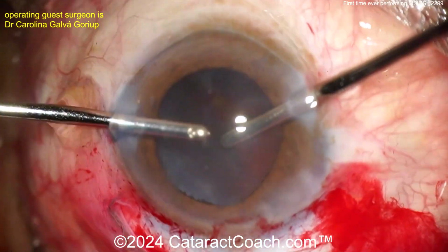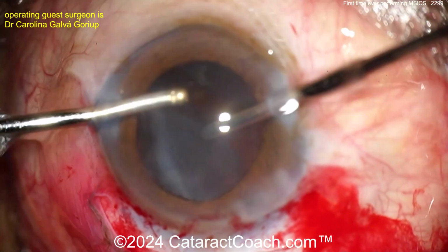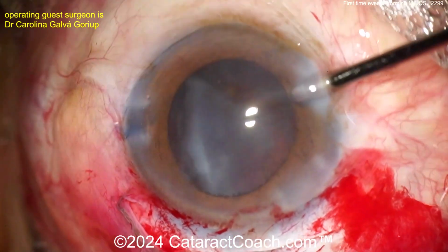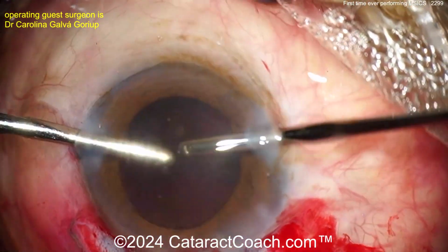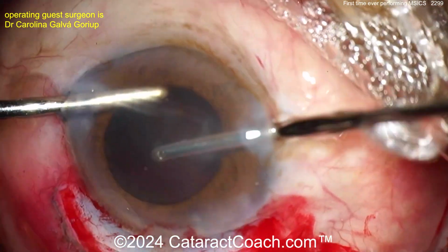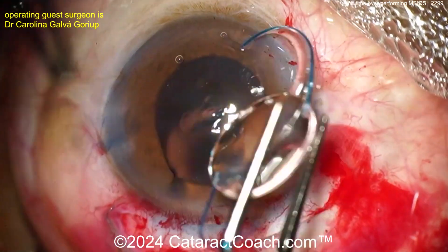It has so much utility, even in fancy pants Beverly Hills. I will use this technique at least a few times a year. You've got a patient with a dense rock of a cataract, loose zonular support, weak corneal endothelium. Why suffer? Why destroy the corneal endothelium with endless amounts of ultrasonic energy and phaco? Just remove the nucleus like this.